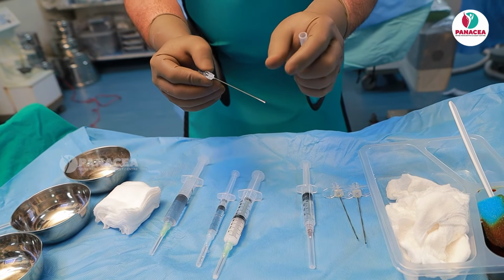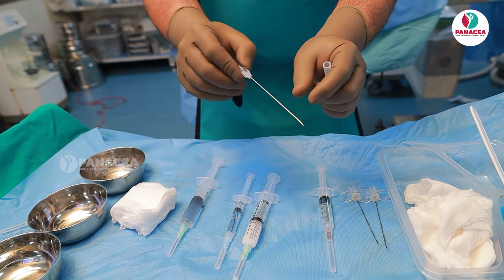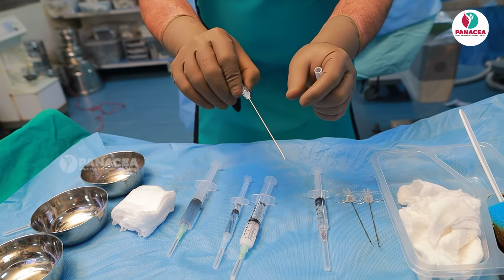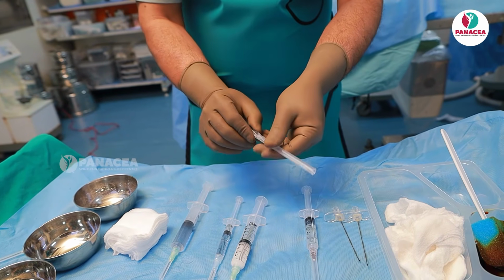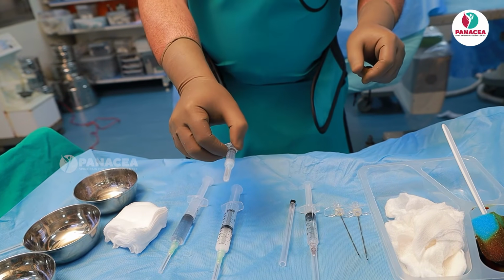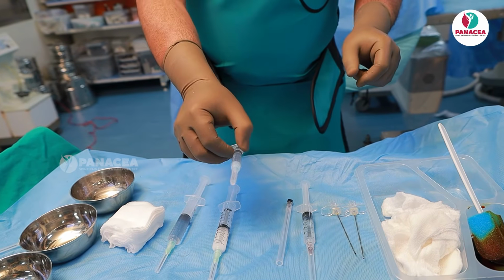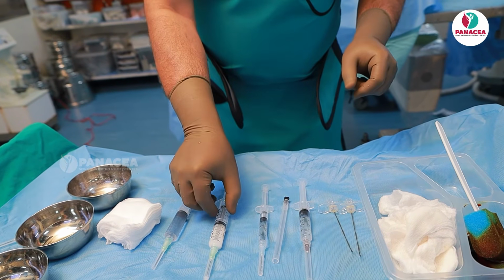This is purely in order to steer the needle to the target area, because if you repeatedly pull it out and push it to the target area, you will end up with too much radiation. So this is the second one. Third is this iopamidol dye. It is 350 milligrams per ml. This is the non-ionic contrast which we are going to use.